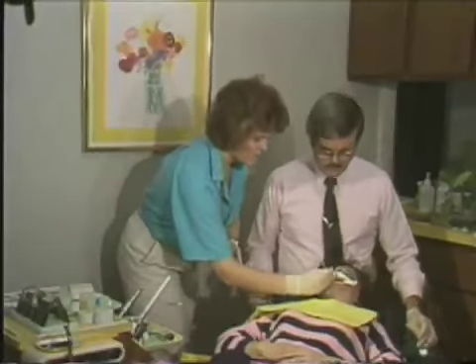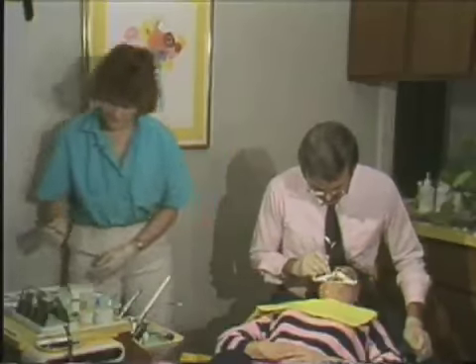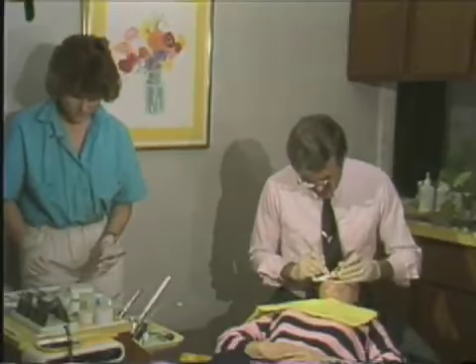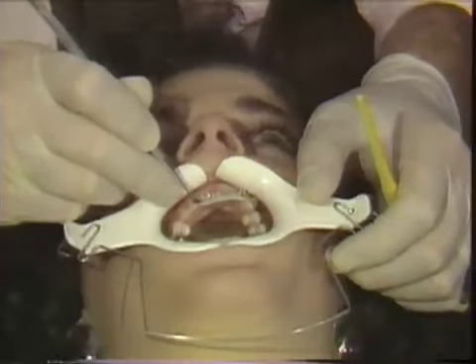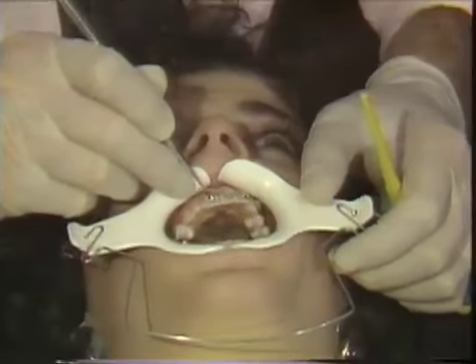The bracket is then placed on the tooth as before. It's positioned. The position is checked with a mirror, then is pushed firmly in place, and then any flash is removed along the outside.